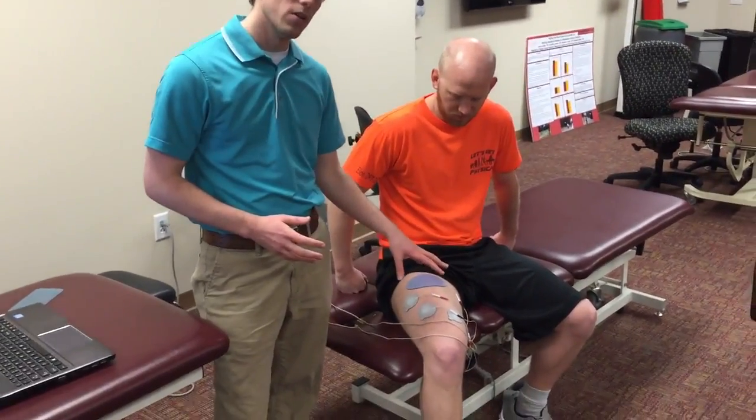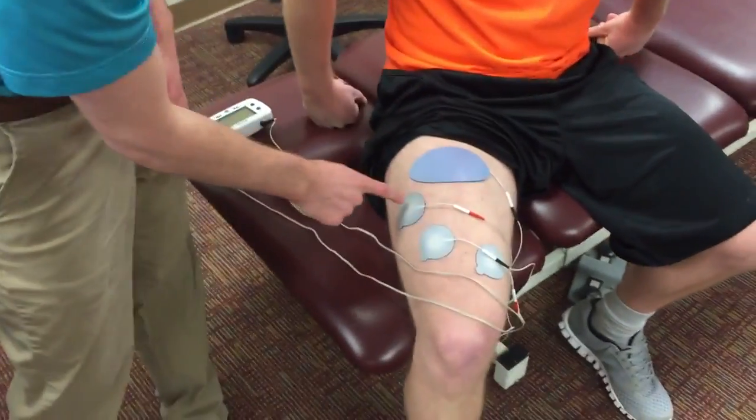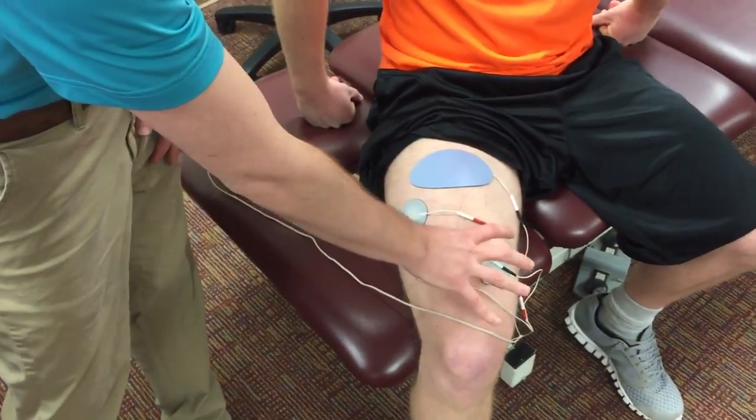It was a custom setting that they used. They used a four-channel unit with a set of four pads just like this — a large pad here and then three pads going around to activate the entire quad.